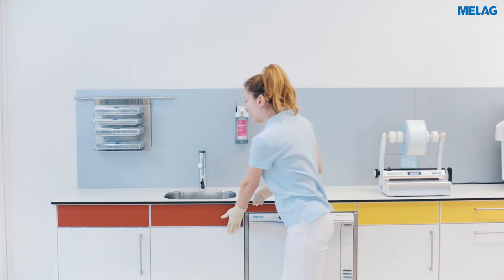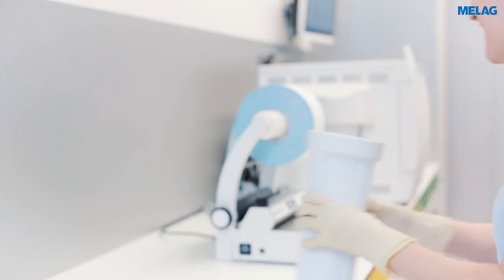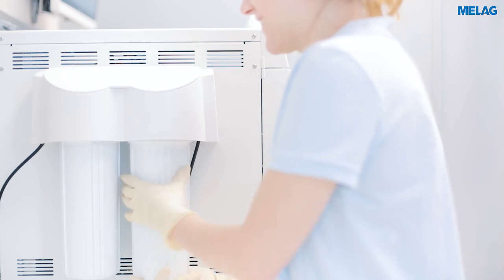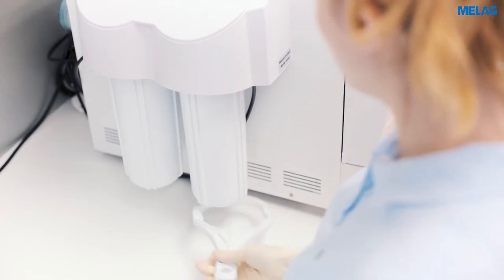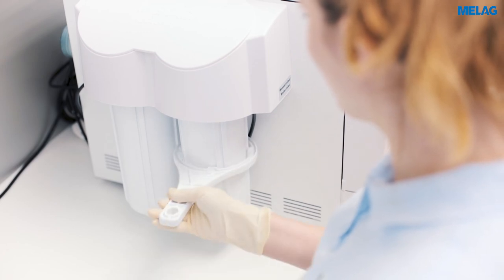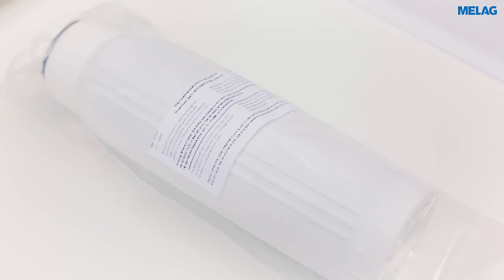Please insert the new cartridge in the thoroughly rinsed cartridge container and screw the container tight by hand and then with the wrench. Repeat this procedure for the second mixed bed resin cartridge.